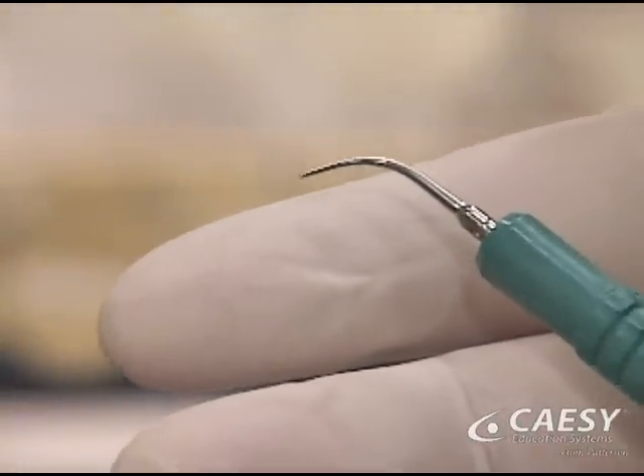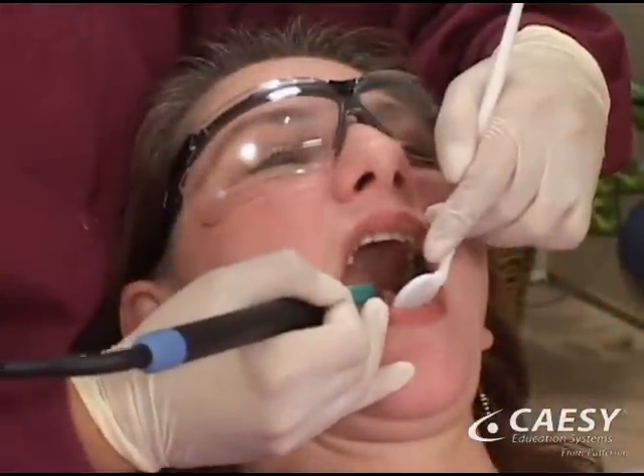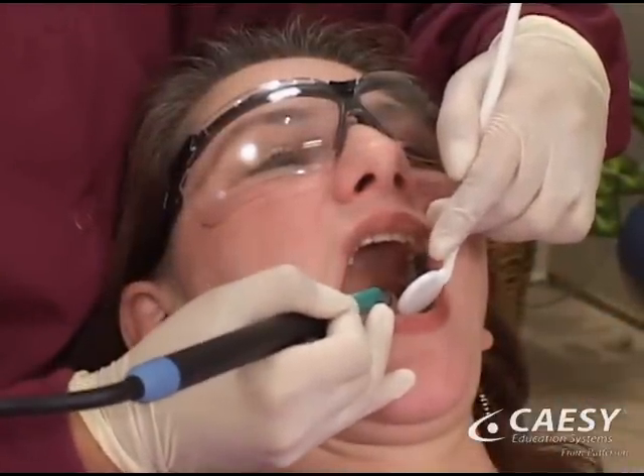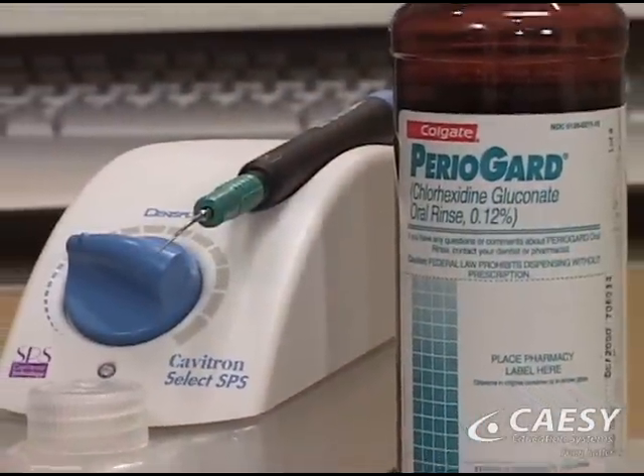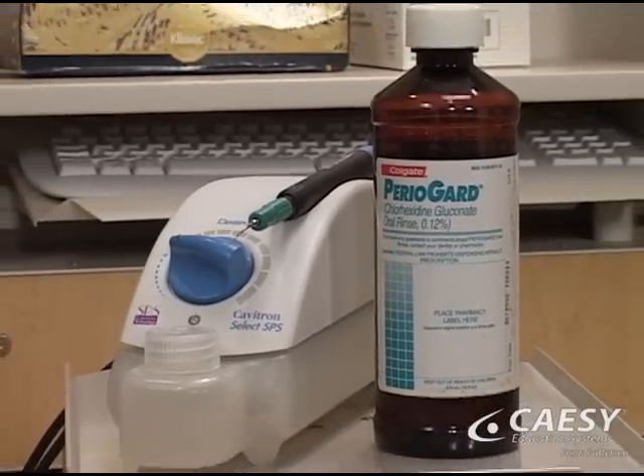Ultrasonic scaling can be more comfortable than hand scaling because the tip is extremely small and much of the work is done without disturbing the gum tissue. In addition, we can add a medicated solution to the water to treat infection and aid healing.